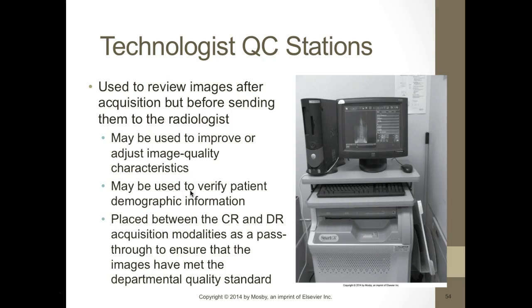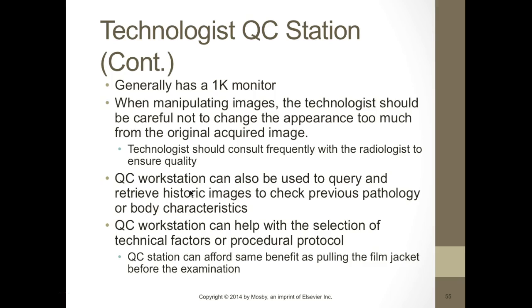So your QC stations, we use those to look at the images before we send them to the radiologist. When we're looking at these, we can improve some of the quality on it, but I don't recommend you doing that. You can use it to verify the patient's demographics. And generally you have a 1K monitor.